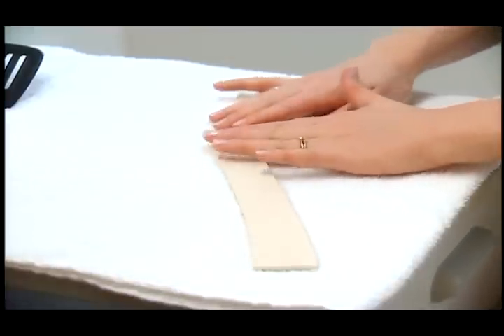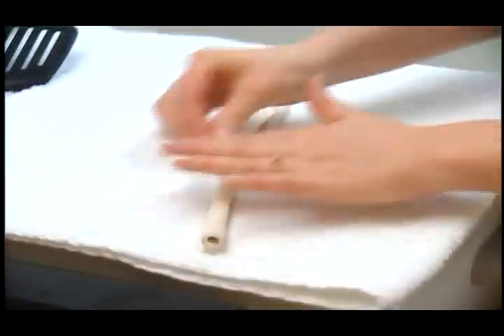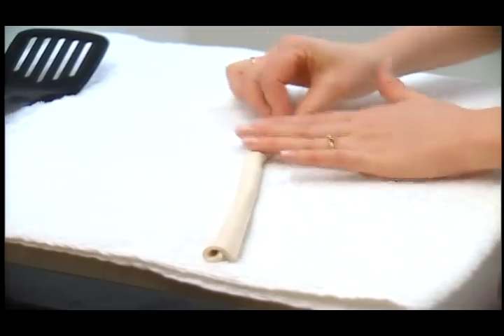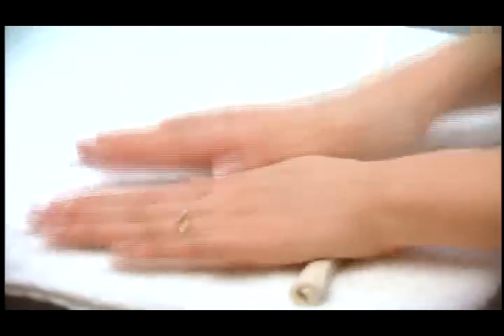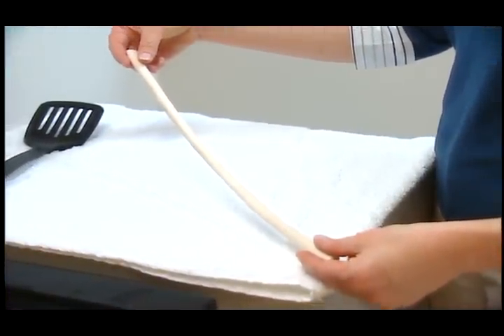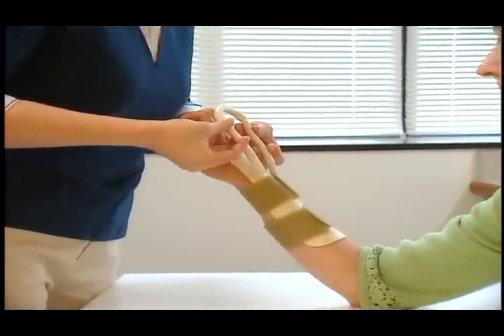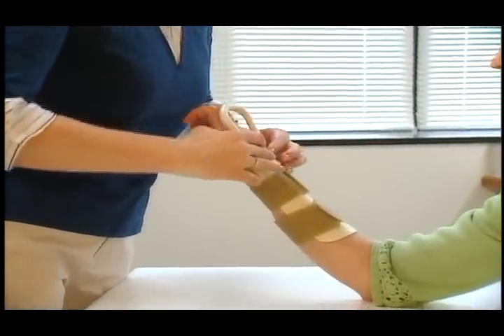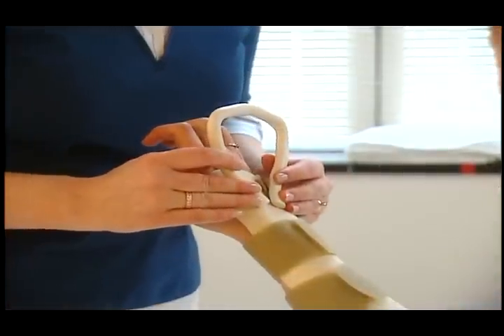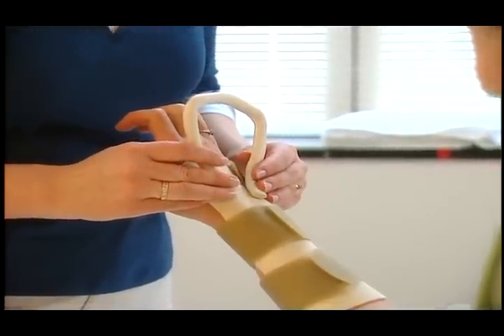Outriggers can be custom made by shaping thermoplastic into a tube, using prefabricated splint tubing, or by bending wire into the desired position. Here the therapist is rolling out a piece of thermoplastic to create a tube shape that can be formed into an outrigger. An outrigger provides a base for positioning a 90-degree angle of pull to the joint that is being mobilized. It is important to line up the outrigger over the joints to be mobilized as it is forming.